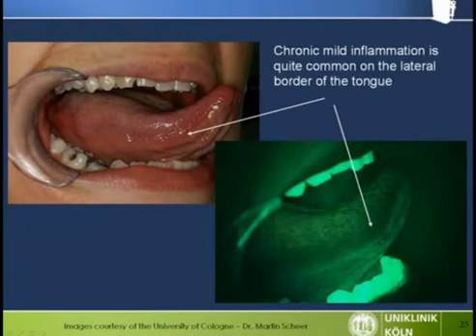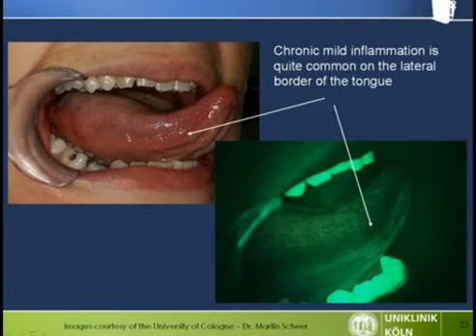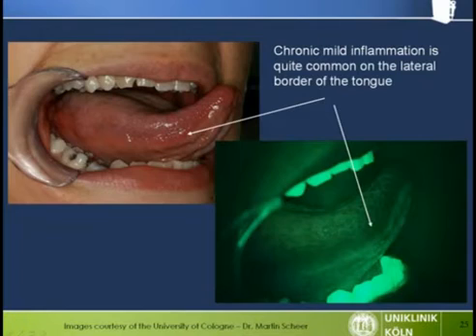It's quite common for the lateral border and tip of the tongue to be inflamed due to chronic irritation from teeth, and thus appear darker under Velscope. The white light picture here shows the redness along the lateral border, which corresponds directly with the homogeneous dark band seen through the Velscope.